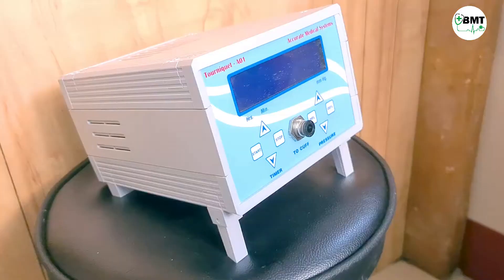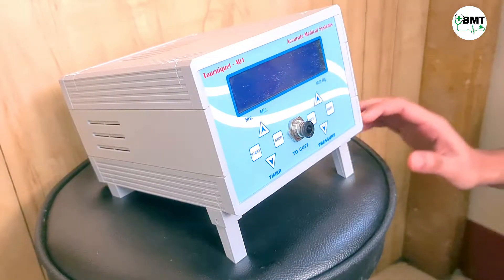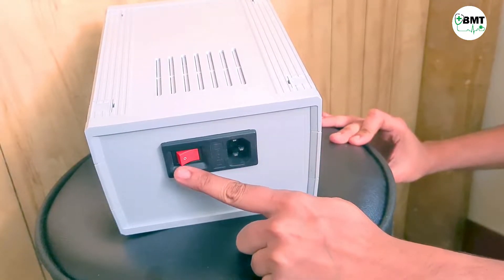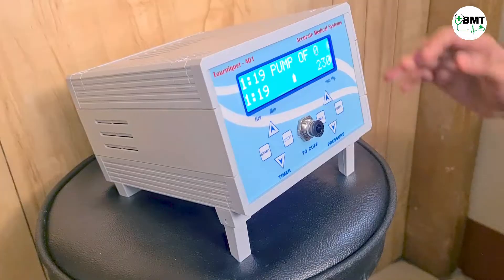This is Accurate Medical Systems tourniquet machine, model A01. Starting with the backside connections: here is the power cord connection, this is the on/off switch, and here is the fuse.